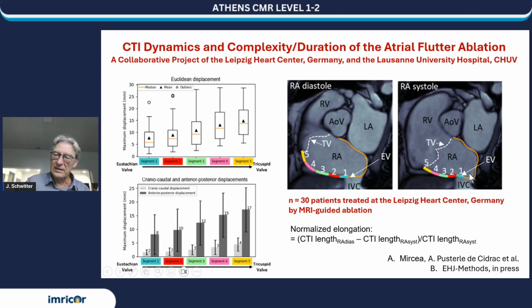This is in systole of the atrium. This is in diastole of the atrium. And if you see the motion, you see most of the motion is anterior posterior, so this direction, and only a little bit of motion this direction. So most of the motion that we see here is in this direction.